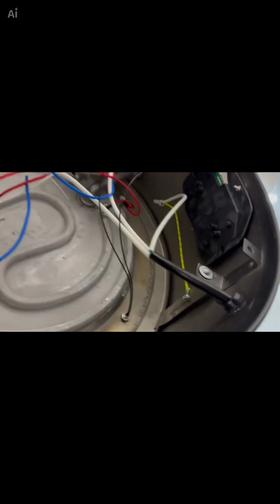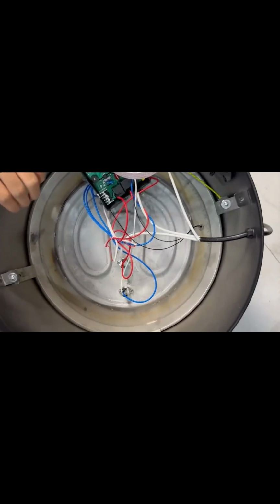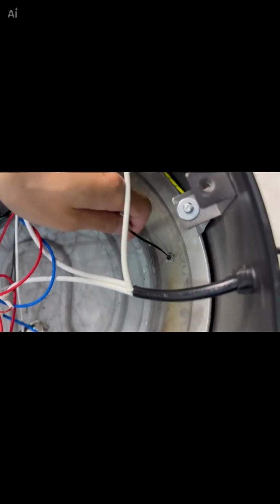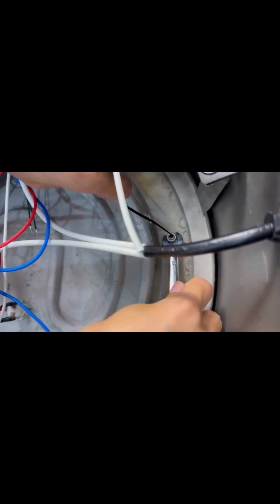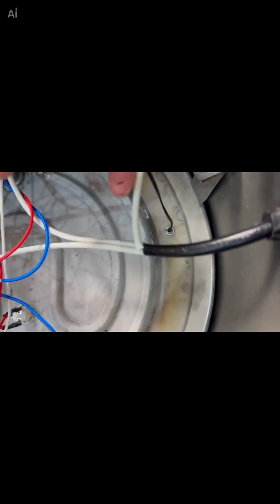All right. Now let's put the tube back upright. Okay. Right here. Let's continue tightening this nut. Now we need our hex wrench. Okay, so just tighten this.